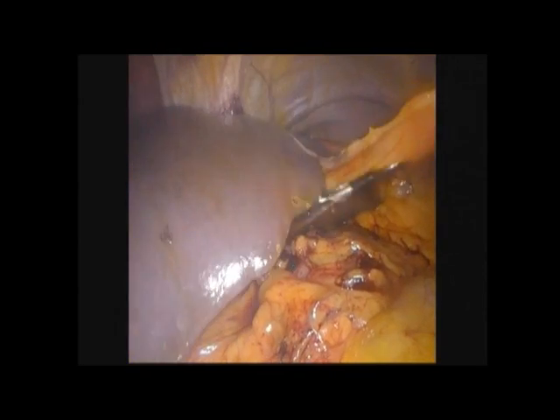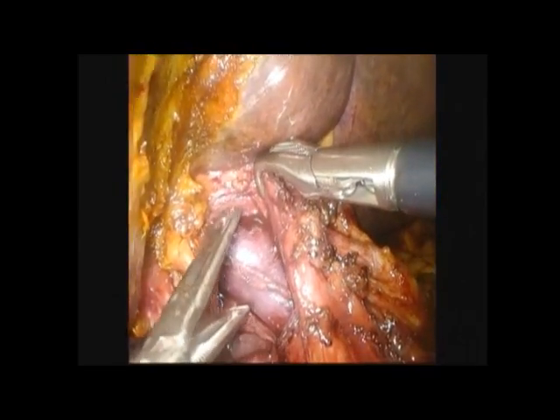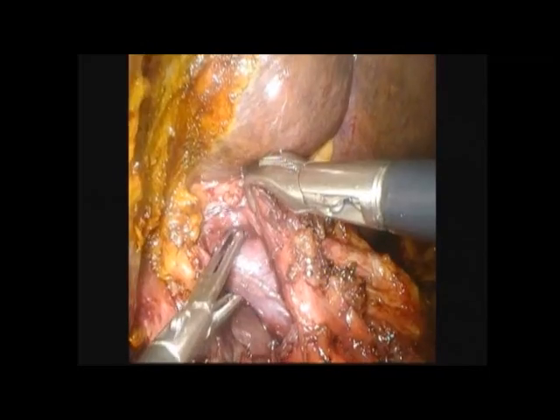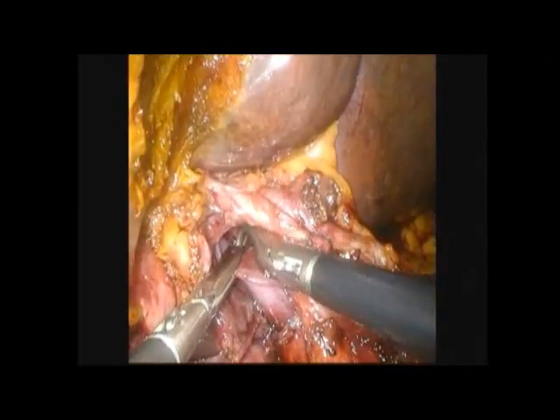This video demonstrates that laparoscopy allows for good visualization of the upper abdomen and porta hepatis. With careful dissection, the porta hepatis with the portal vein and other structures can be visualized and ligated. Here, the right portal vein is being encircled.